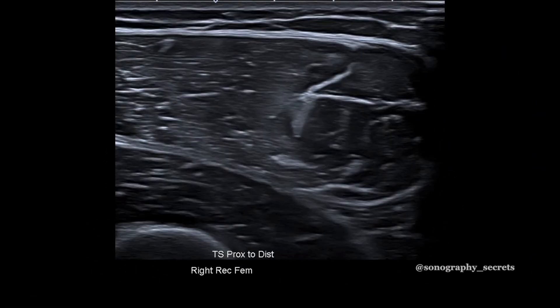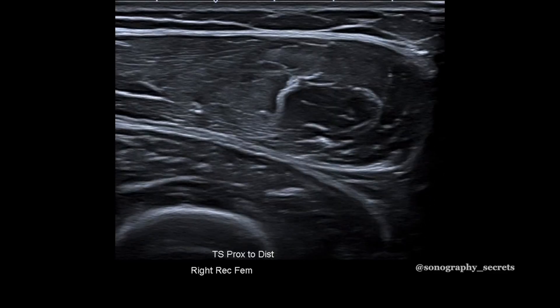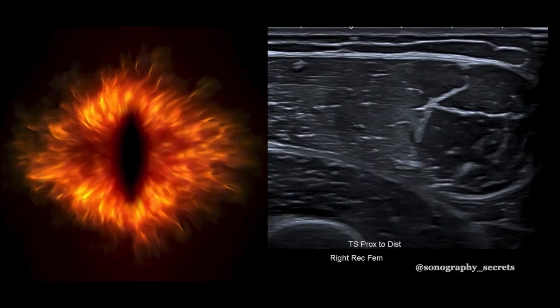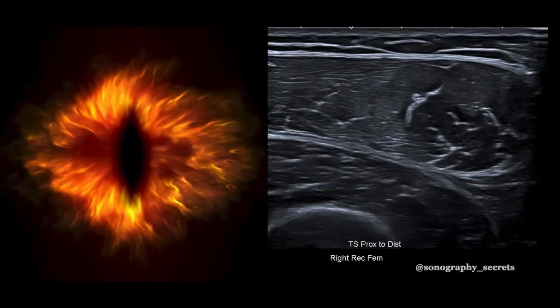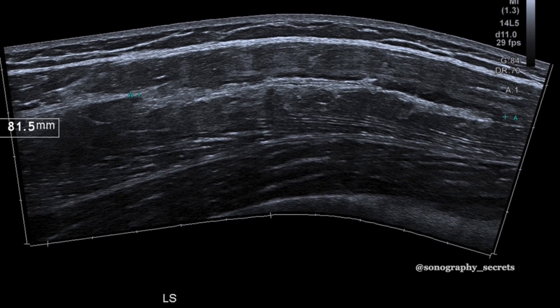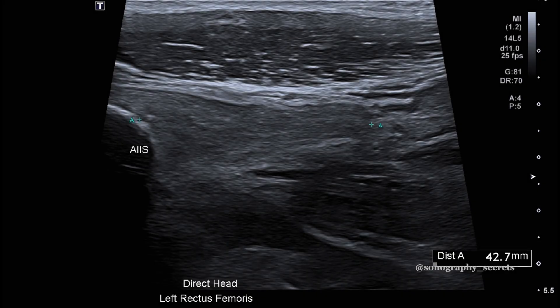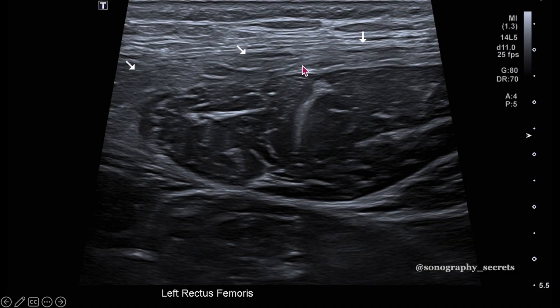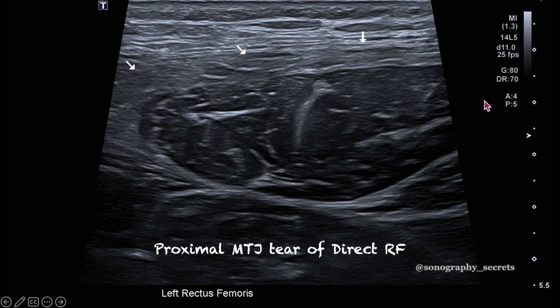In a similar kicking injury we can see an intact indirect tendon but we have a tear of the muscle fibers attaching to the tendon. The iris sauron analogy is often used with these injuries, but I find these analogies to be as tenuous as they are tedious. This is a proximal musculotendinous junction tear of the indirect rectus femoris with an intact tendon. Occasionally this is referred to as a paraceptal injury, a term that I find confusing. Here's a cool case post sprinting — we can see with the direct component an intact origin, but just distal to its origin we have irregularity and edema at the superficial or anterior aponeurosis, meaning we have a proximal MTJ tear of the direct rectus femoris component.